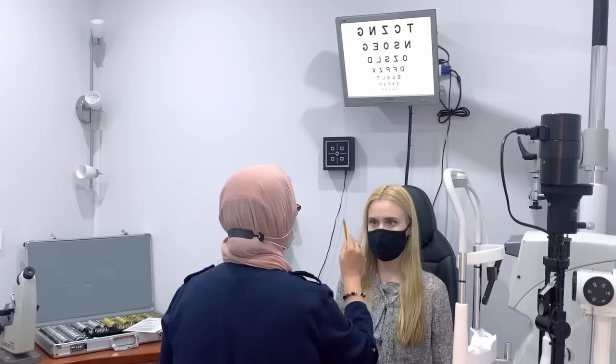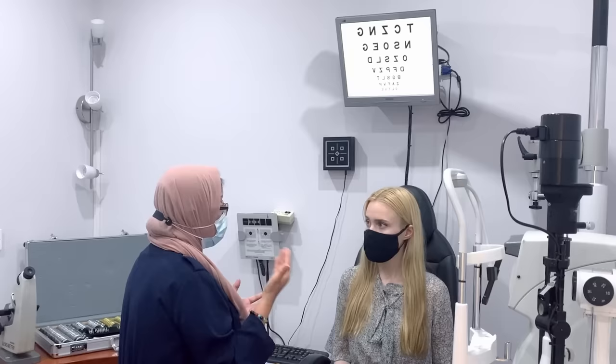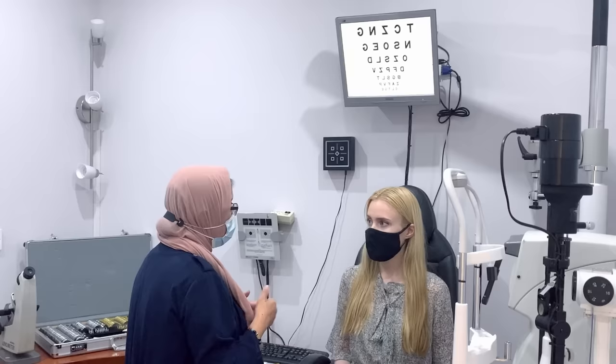That's perfect, thank you. Okay, so now we're going to move on to looking at the ocular health. So I'm going to look at the front of your eye. I'm going to take your eye pressures. We're going to look at the back of your eye with a digital image. And then we're going to do something called your peripheral vision. All right, okay, so that's the next stage. Before we go on to that, is there anything you want to ask about the prescription?